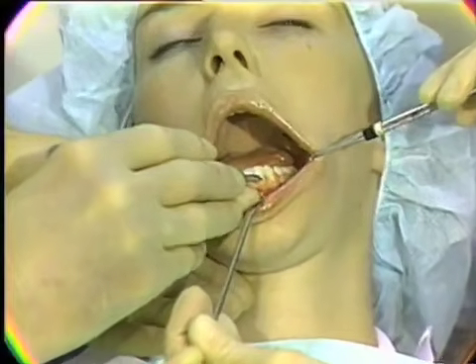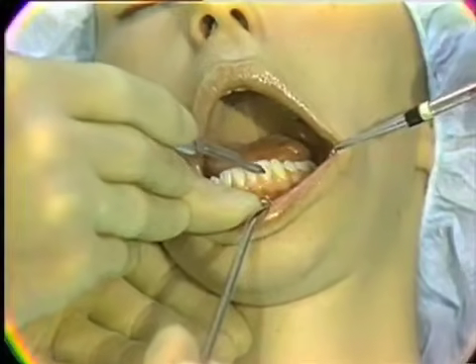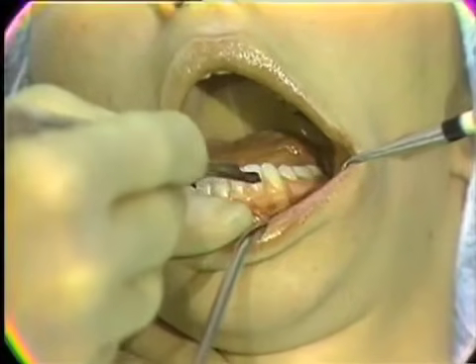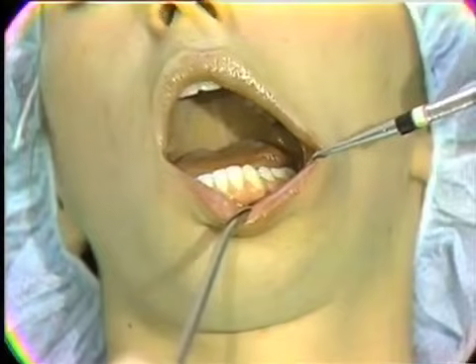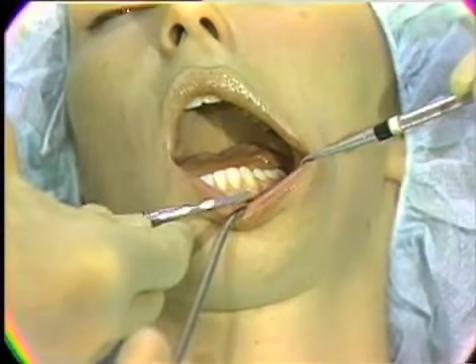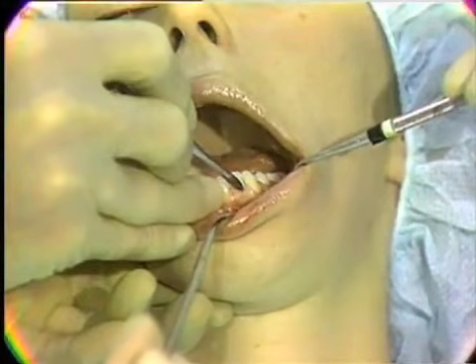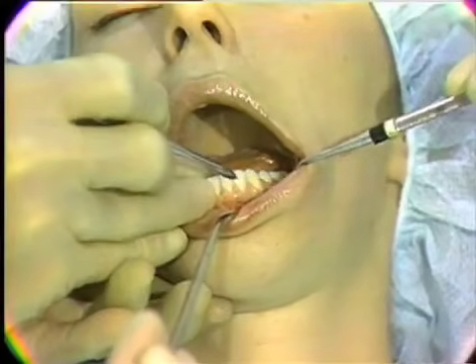And as you start to apply pressures, here we are using the 15 blade in the manner that is shown, going into the gingival sulcus. And we would divide the epithelial attachments, keep the blade in contact with the tooth as we go into the embrasure. That would be followed by the use of the periosteal elevator, the small end of the periosteal elevator, and utilizing a rest finger on the teeth, we would then go into the base of the papilla, go down to alveolar crest of bone and reflect the flap out.